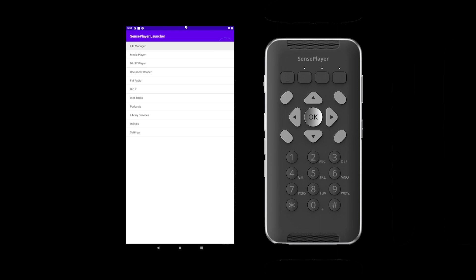This is a video on how to access and use your OCR in your Sense Player device. OCR refers to optical character recognition, which simply means the recognition of letters in an image and the conversion of those letters to text.